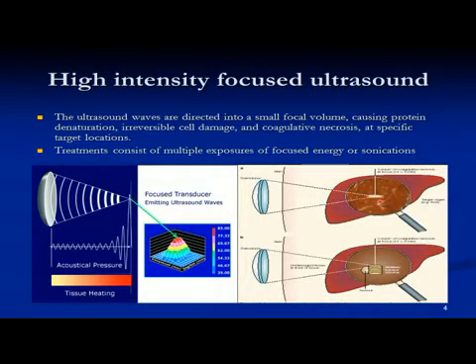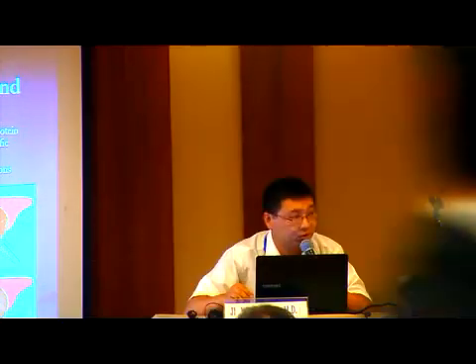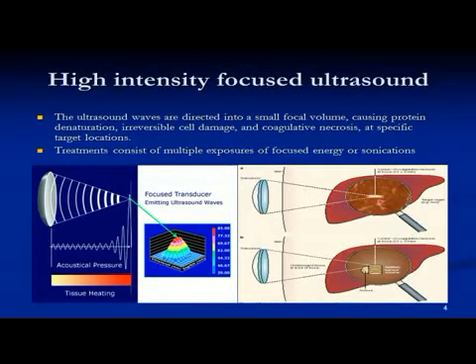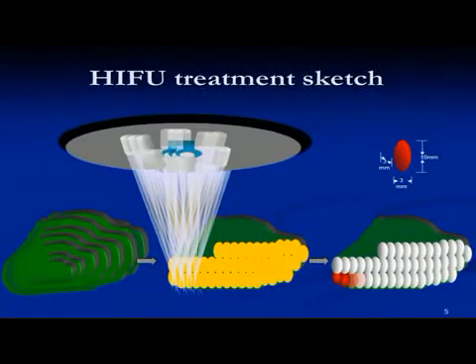HIFU makes waves penetrate and be focused in the body, just like the focus point of sunlight can generate high temperature. Wave itself is a green means. Ultrasound examination is allowed for pregnant women, but radiography is forbidden. Waves have penetrability and directivity. They can generate a high temperature if the energy density of the focus is big enough. HIFU is the equipment which focuses waves to generate the therapeutic effect.